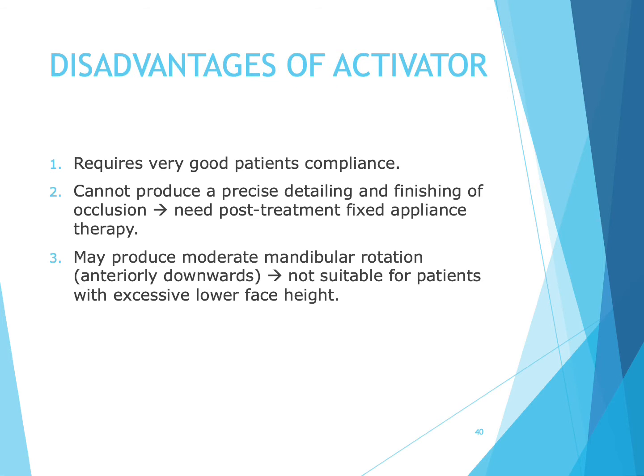So now, what are the disadvantages of the activator? It requires very good patient compliance, it cannot produce precise detailing and finishing of occlusion, and it needs post-treatment fixed appliance therapy. The activator may produce moderate mandibular rotation, anteriorly downwards, and is not suitable for patients with excessive lower face height.